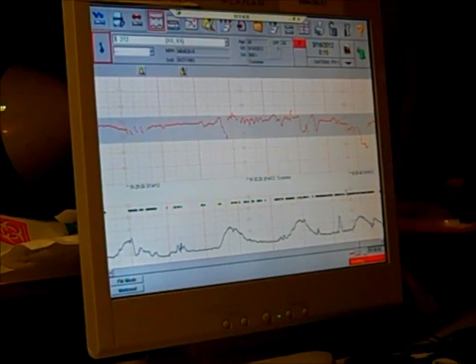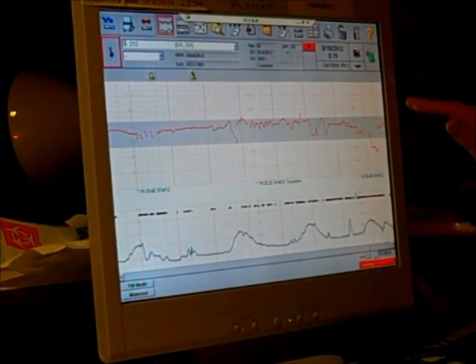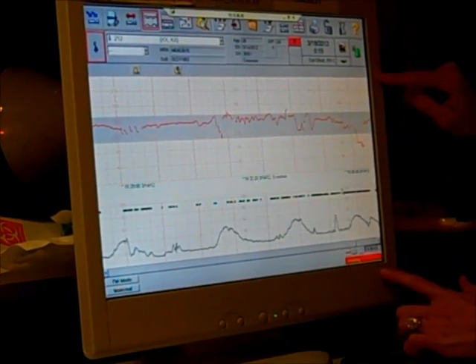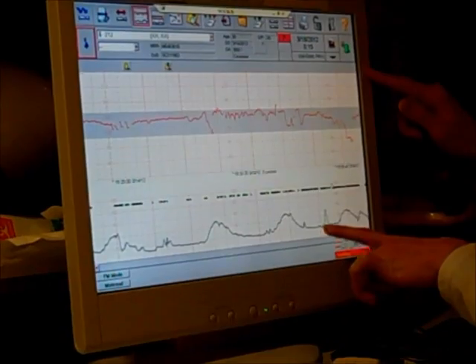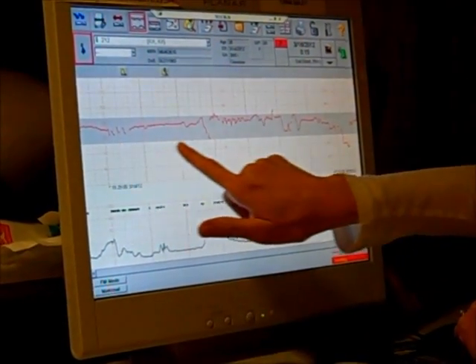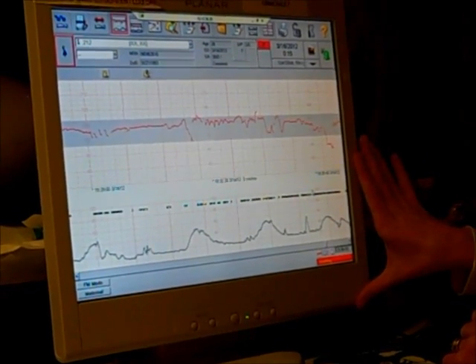So after you've completed your vitals, you're going to do what's called monitoring the fetal heart tone and the contractions. And you can see here an example of a contraction pattern. You can see the contractions here on the bottom, little mountains, and you can see the fetal heart tracing. And you may wonder, how do we pick this up and how does it get on this computer screen?